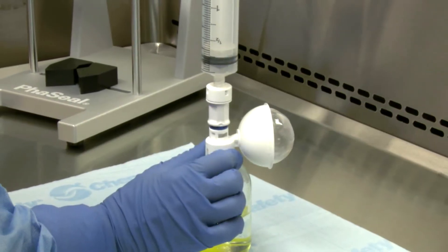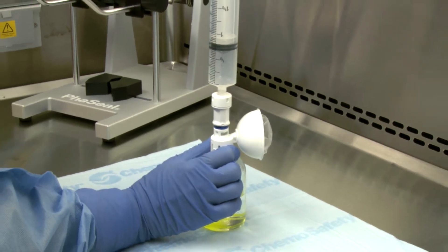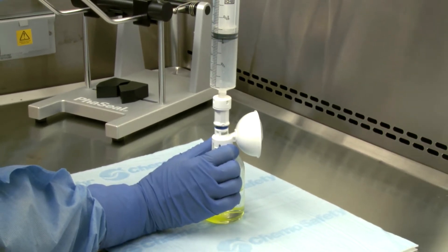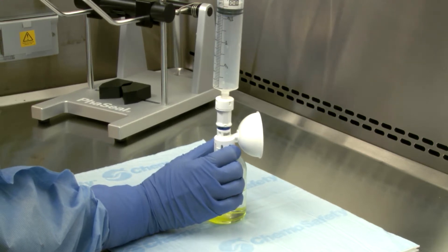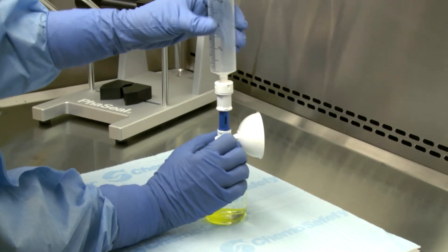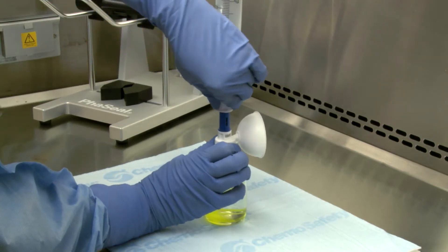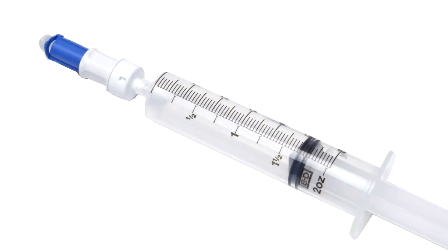While the first syringe unit is still engaged and the vial assembly remains on the flat surface, pull back 50 mls of air from the vial into the syringe unit. The expansion chamber will now deflate. Then disengage the first syringe unit from the vial assembly using the pull-turn-pull disconnection method. This syringe unit can now be discarded or may be used for further preparation if the final dose required is greater than 50 mls.